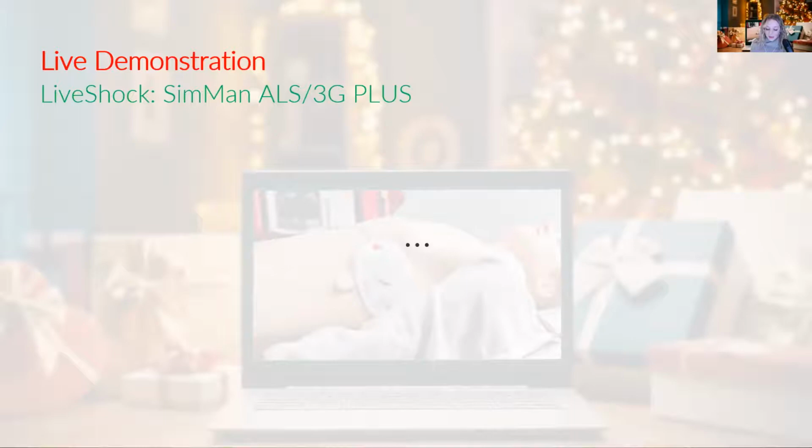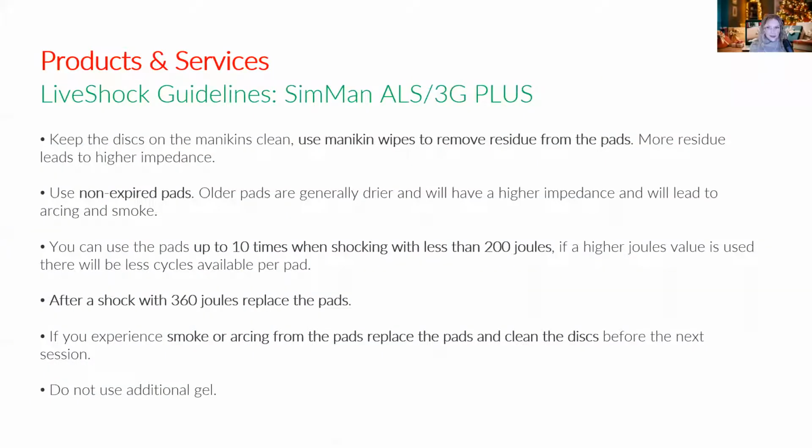So you'll enjoy that. But before he comes back on, these are some of the guidelines that we have around LiveShock and some of the best practices to keep in mind when you're working with this product, specifically around disc and pad cleanliness and usage. Let's start with the first one, which is to keep the discs on the mannequins clean. We're going to see that in a moment with Shane in the sim lab, but using mannequin wipes is a really nice way to remove residue that the pads leave on these discs. More residue leads to higher impedance with this product, so ensure that those are clean. And again, if you use the mannequin wipes, just ensure that those discs are clean prior to putting the pads back on.